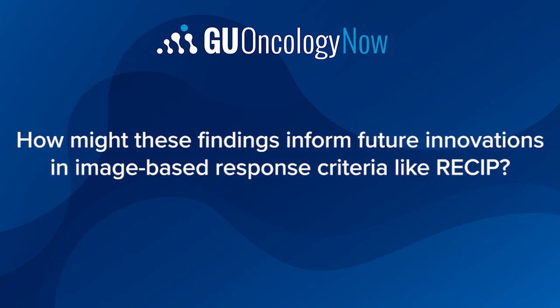The other limitation is we had only 73 patients with both PET and SPECT. We will need more patients to make this result stronger. This study first demonstrated that we can apply standardized criteria that were used in PET to SPECT.